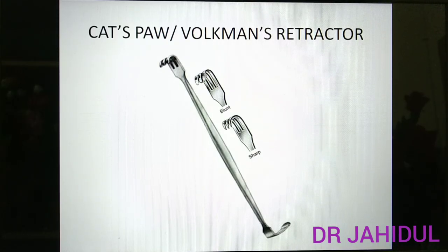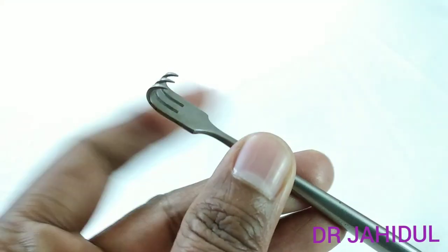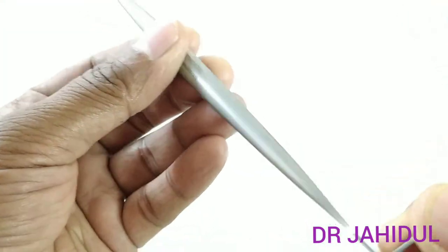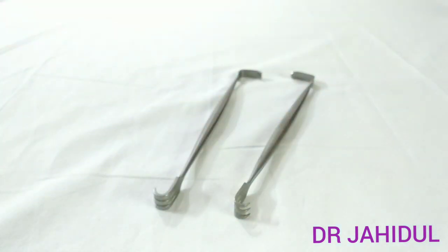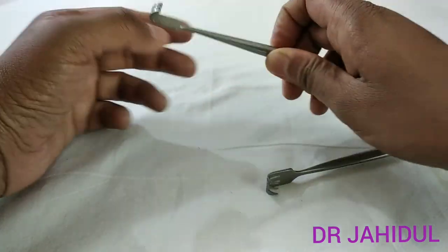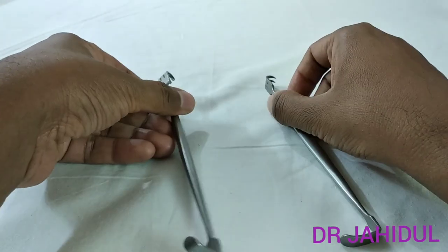This is the cat's paw or Volkmann's retractor. It has multiple hooks with pointed or blunt tips; on the other side there may also be a small right angle retractor, which may be present or absent. It is used to retract fascia in the sole and palm, and to retract skin flaps in superficial operations like sebaceous cyst, lipoma, and dermoid excision. As a blunt instrument, it is sterilized by autoclaving.